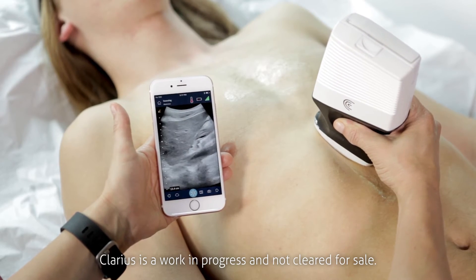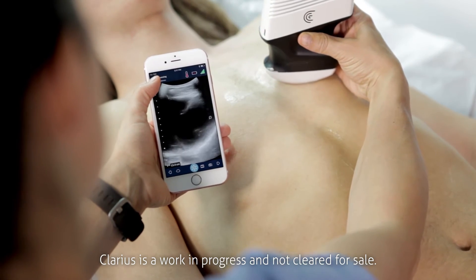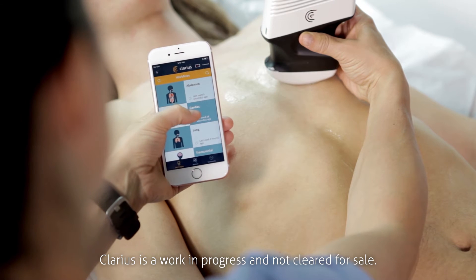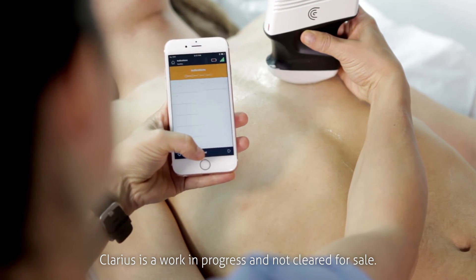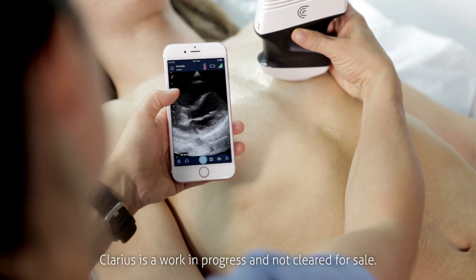There's no need to change transducers in the middle of an exam. With the Clarius app, you simply select the part of the torso you want to view and start scanning. The cardiac option on the app switches the probe from curved to phased array imaging.